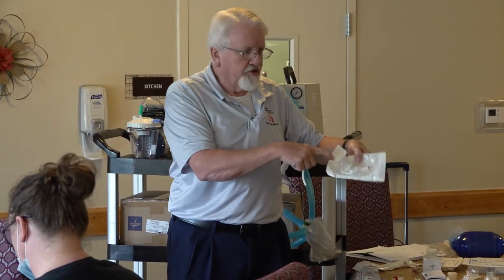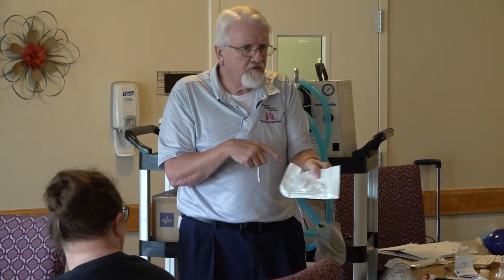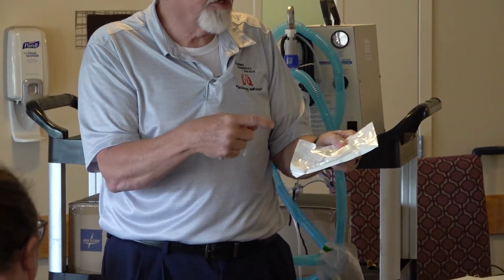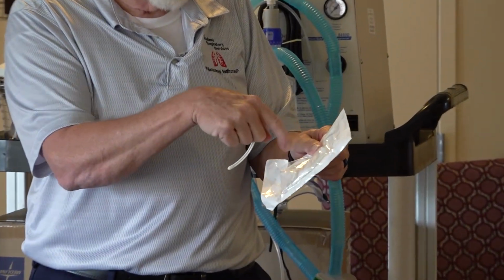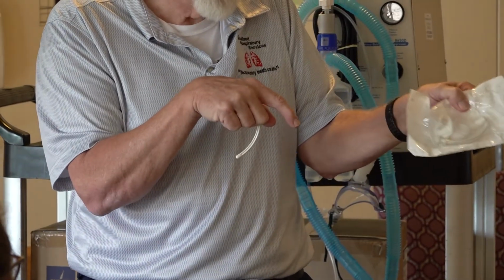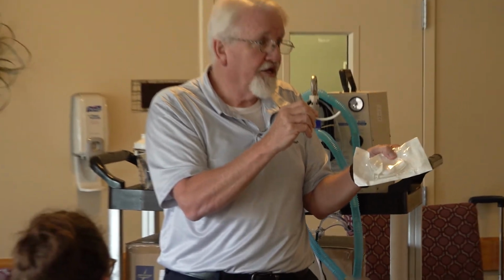what I actually do is, so this is a brand new trach, and so when I open this up, inside there is sterile, and then when I get the trach and everything out of the little bag that it's in, inside this, that's what I use to put the obturator back in when I get done.